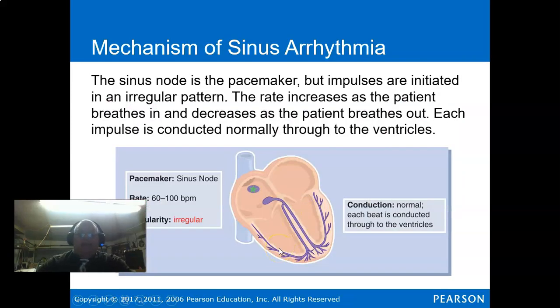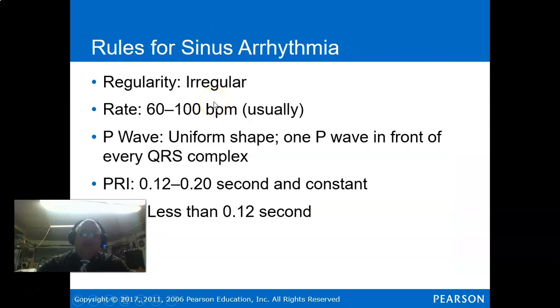Now, sinus arrhythmia. Up until now, we've talked about sinus rhythms being usually very regular. Most of them are. However, there are sometimes where that doesn't happen, especially when you have an immature system. Kids, especially, when they breathe, they'll do this. It's called sinus arrhythmia. What that causes is a brief delay, a brief pause, usually caused by the SA node not getting a signal because of the pressure being put on the autonomic nervous system. It just slows the conduction a teeny tiny bit, but it's enough for us to see irregularity.